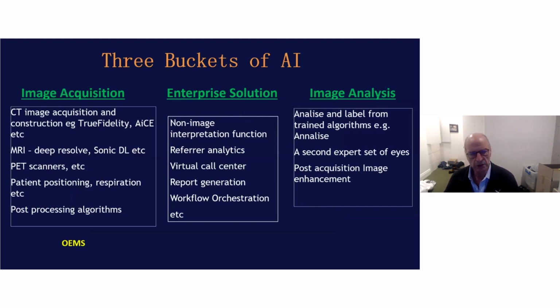There's image acquisition. For example, they use AI algorithms to get CT images, using AI algorithms to look in k-space and get MRI images, etc. And this really belongs to the OEMs. It's not something we as a company would look at.